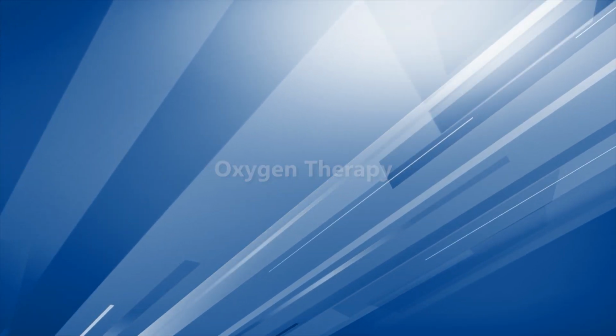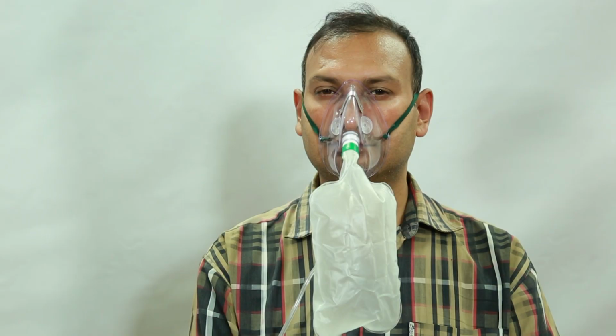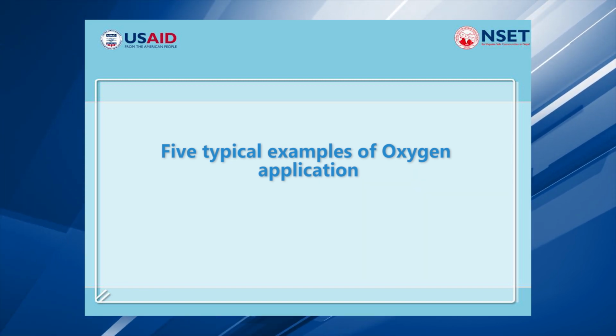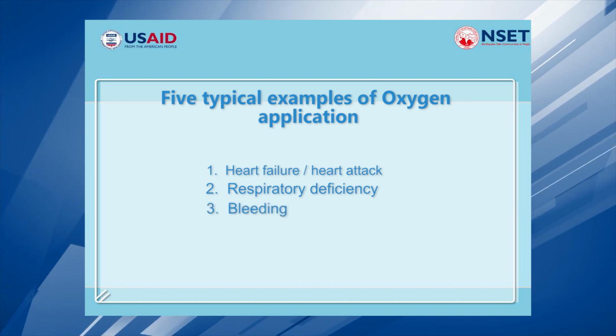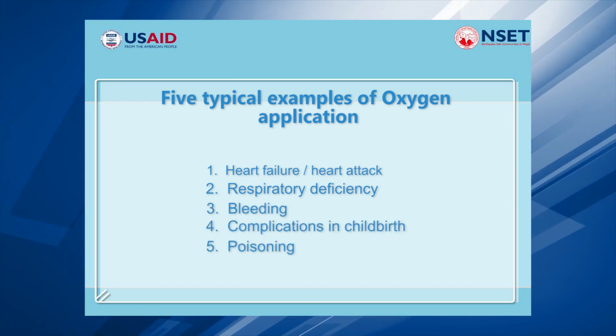Oxygen therapy. Indications for oxygen use. A patient can require oxygen for a variety of medical needs. There are 5 typical examples in which the application of oxygen is indicated: heart failure, heart attack, respiratory deficiency, bleeding, complications in childbirth, poisoning.